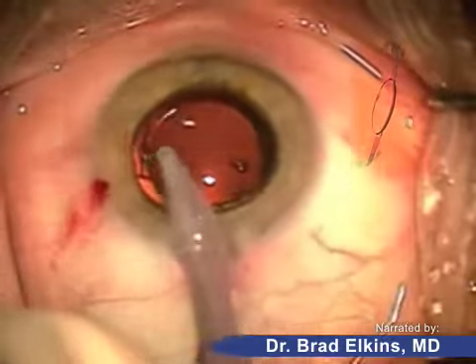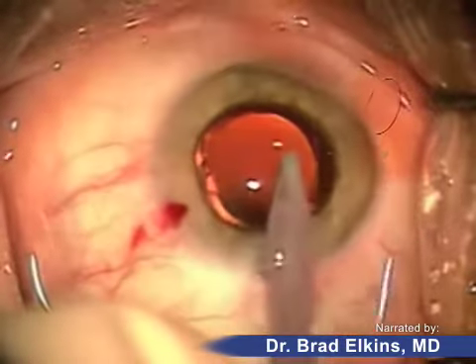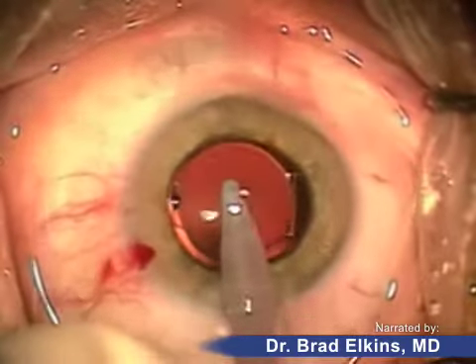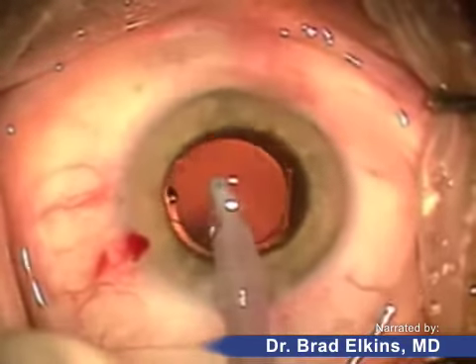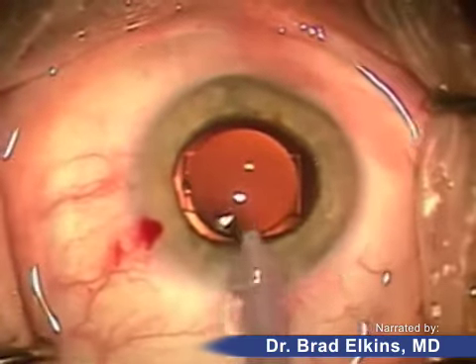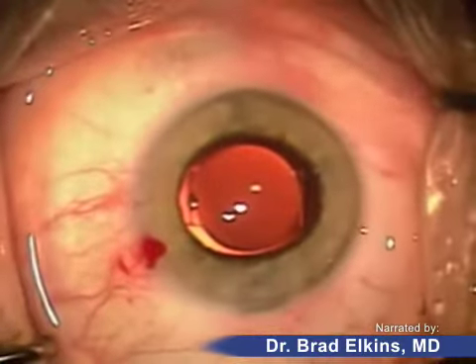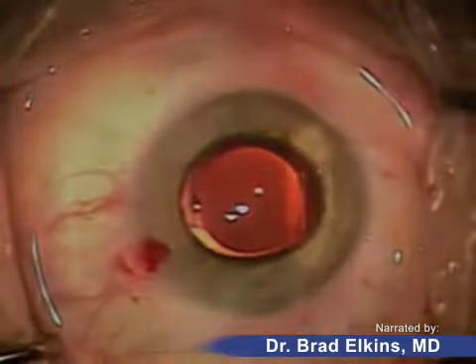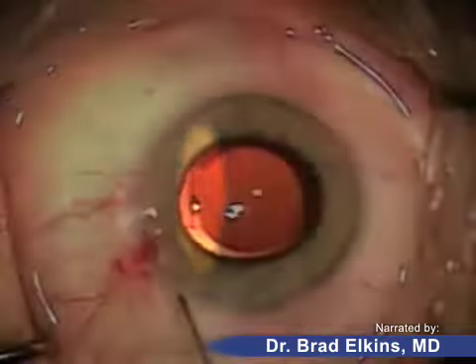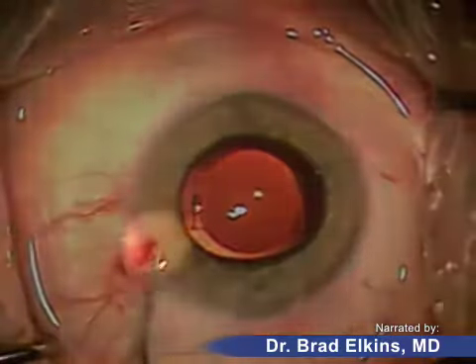The lens is being positioned in the correct orientation to achieve maximal accommodation. The viscoelastic is being removed from the eye as the lens is being centered. This is the optic — almost like a contact lens — with one hinge here and another hinge there. This lens is able to move back and forth as the patient makes muscle movements to achieve accommodation.